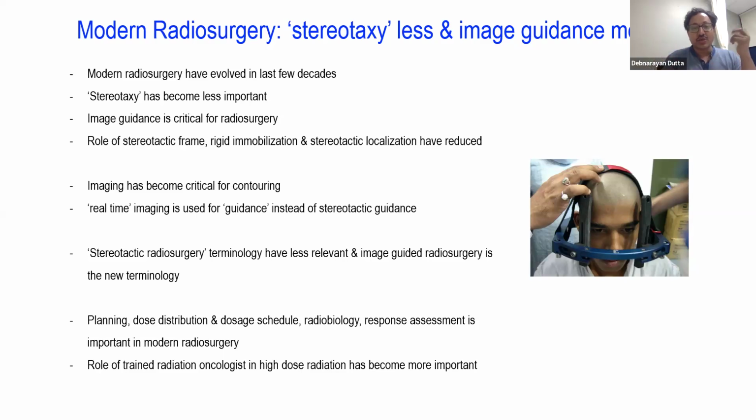But now, as there is no frame, we don't call it stereotactic radiotherapy. Now it is all radiological based. For CyberKnife, and in fact for linear accelerator TrueBeam also, a scan is done. You match the scan, MRI or CT scan, and then treat. There is no stereotaxy, no fixation.